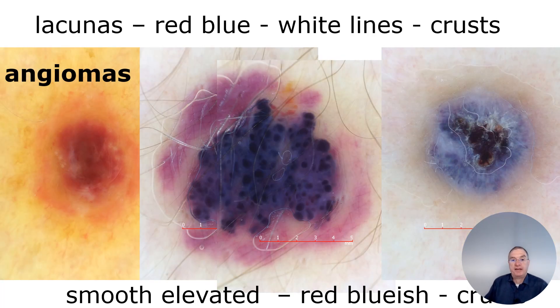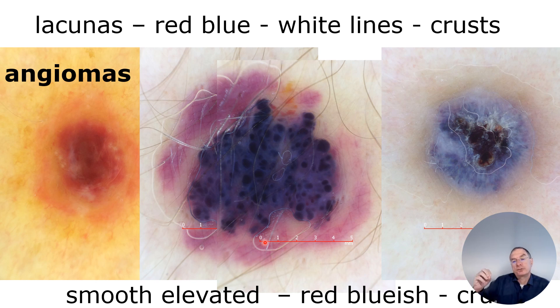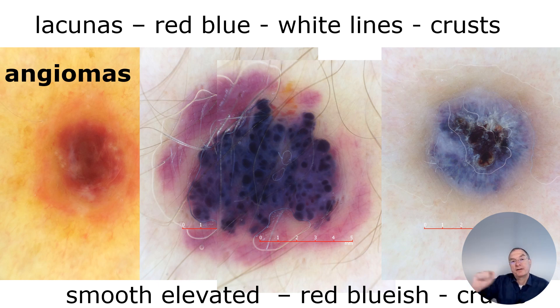Angiomas can also be irritated, and then it is a little bit tricky. On the left hand side it is still benign. Look at the lesion — it is homogeneous in the surrounding, a little bit reddish, and here we also see a deeper located angioma with a lot of irritation. It looks like a sugilation or bleeding just inside, either sub-epidermal or perhaps even epidermal, but nevertheless it is only irritated. Also an irritated angioma on the right hand side with a little bit of a crusty area on the top — that means there was bleeding and now some crust. Just tell the patient: stop scratching.